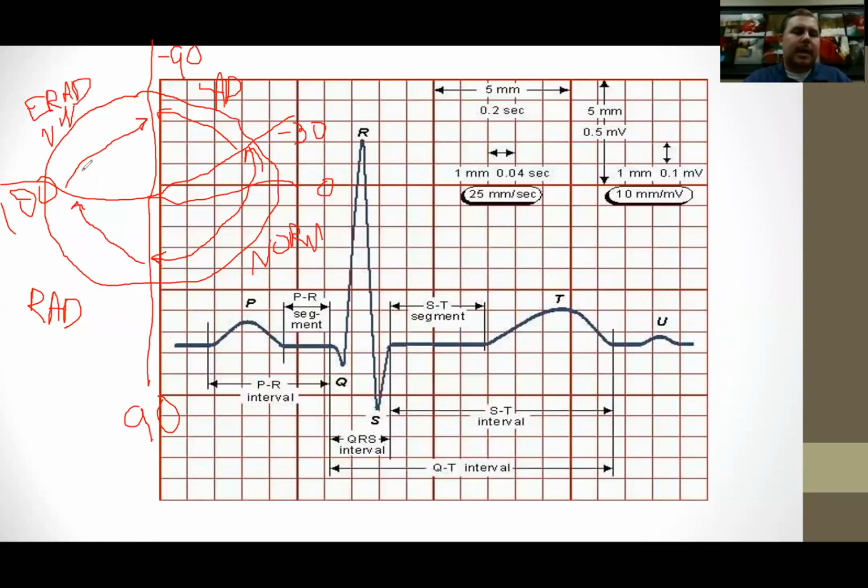Out here is where people have an argument about how to label it number-wise. It could be negative 90 out to negative 180, or it could be 180 out to 270. So there are going to be several different interpretations.